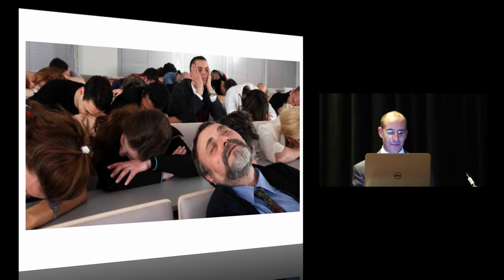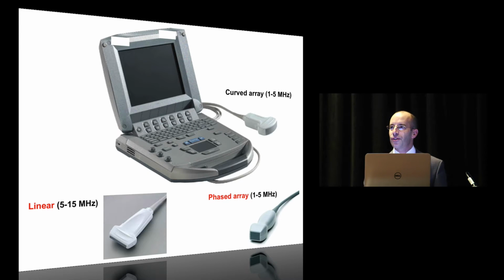So why is it important to learn or start appreciating ultrasound? Well, we have a unique advantage in OB: pretty much all of us have that little machine there, because the OBs have been using it for a long, long time. So we don't even need to buy any equipment, and you'll see that it has a curvilinear probe attached because they're doing abdominal ultrasounds. With that you could easily do neuraxial ultrasound as well as TAP blocks, so you can already start doing some of the applications.